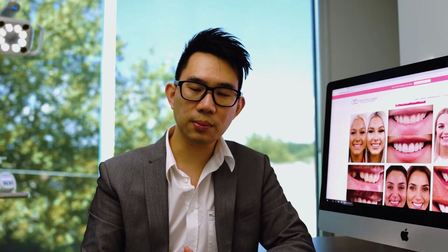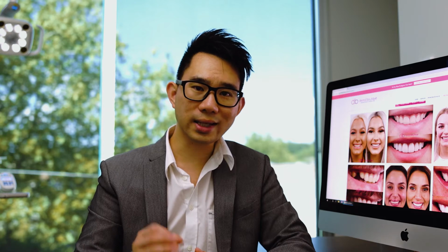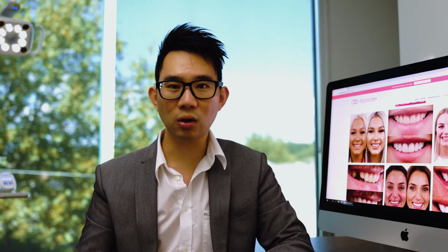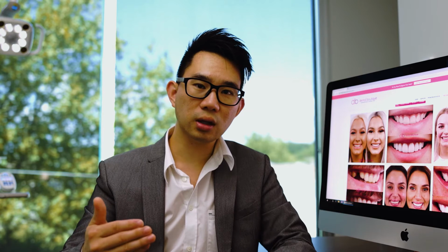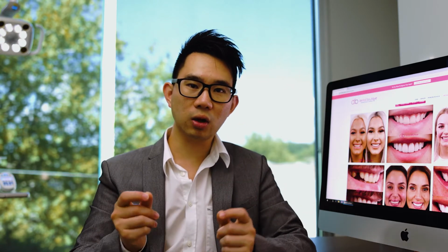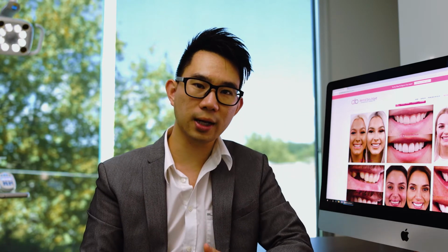The other point about braces is that because it's fixed, there's less compliance on your behalf, meaning that they will definitely work. There's no such thing as whether it will work or maybe it will or maybe it won't. They will move your teeth as long as the dentist places them where they're meant to be, because braces in general have the wire that automatically moves the teeth to the right position without any effort on your part.